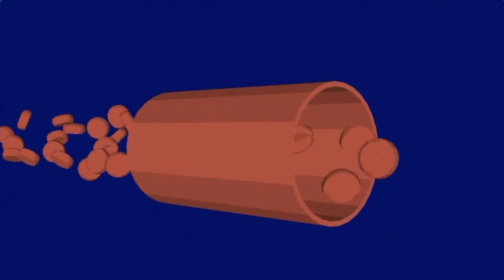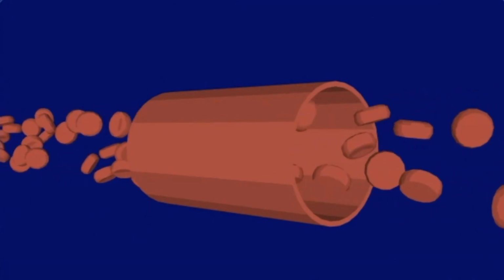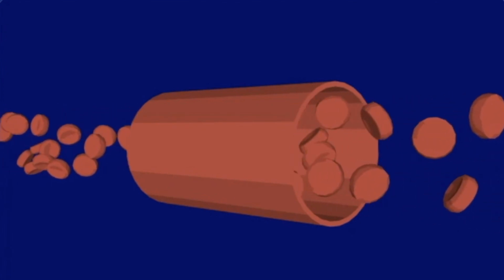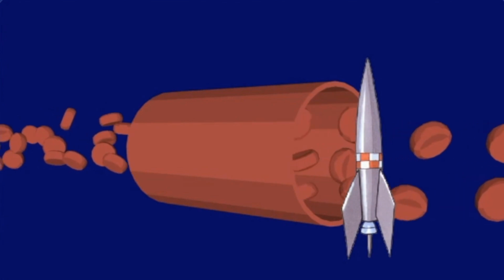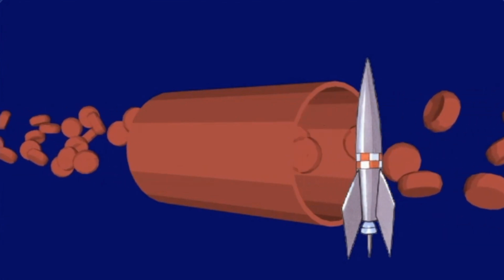The fact that flow influences the MR signal has been known for a long time. The first experiments on this subject were carried out more than 40 years ago. Interestingly, this phenomenon was used to measure flow in the fuel pipes of satellite rockets, without having to put any obstruction into the flow lines.